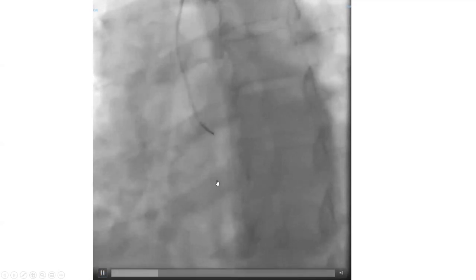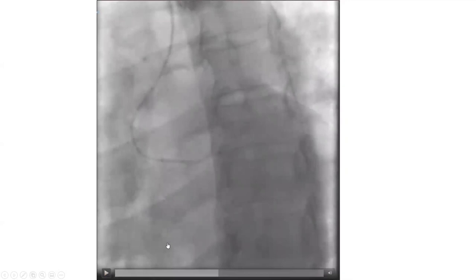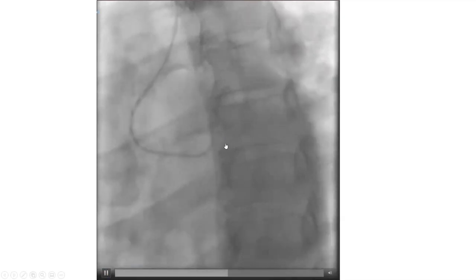It didn't engage — the catheter came around the ostium but we never got in the plane of that left coronary. So you adjust: we couldn't engage from below, so we were willing to take a risk of engaging from above, despite the difficulty. We tried from below, it didn't work; we tried from above, and vice versa. Eventually we decided to try from above, and it worked — we pulled with a clock maneuver and it jumped in. Most often clockwise is the one that works, but it's not universal.